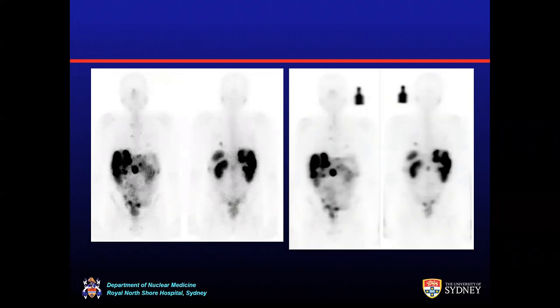This image also demonstrates the smearing effect, where the lesions on the true planar were slightly sharper and had a higher spatial resolution than the reconstructed data. Here we can see the reconstructed data edges are a bit more fuzzy and smeared out.